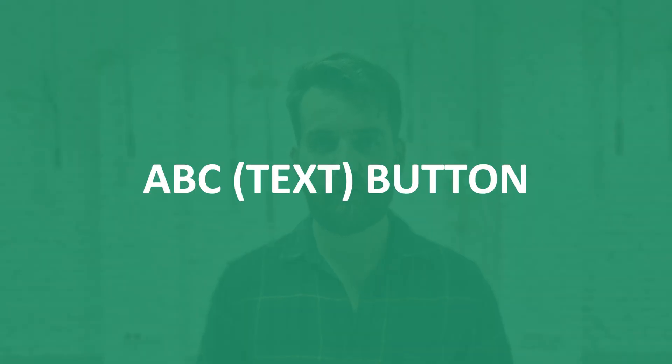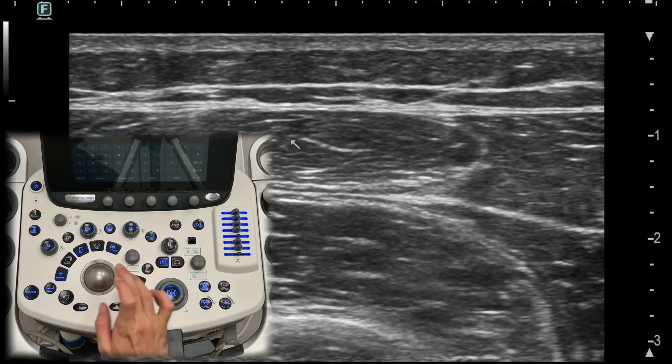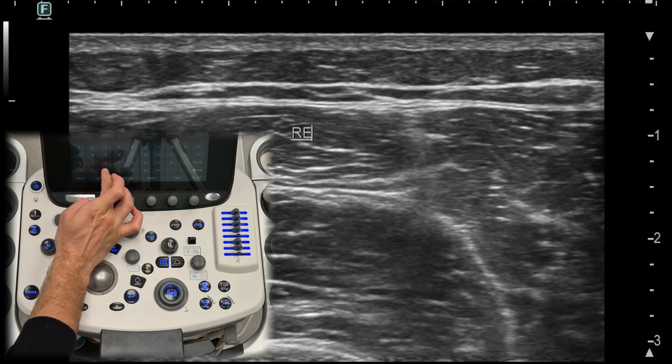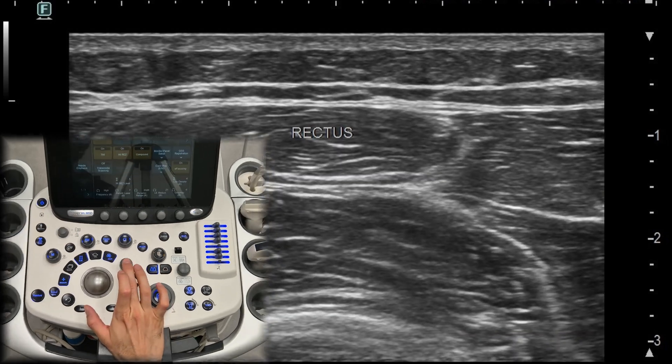ABC or text button. The ABC or text button allows you to add annotations or text directly onto the ultrasound image. This is useful for labeling structures, indicating areas of interest, or adding notes to the image for documentation purposes.